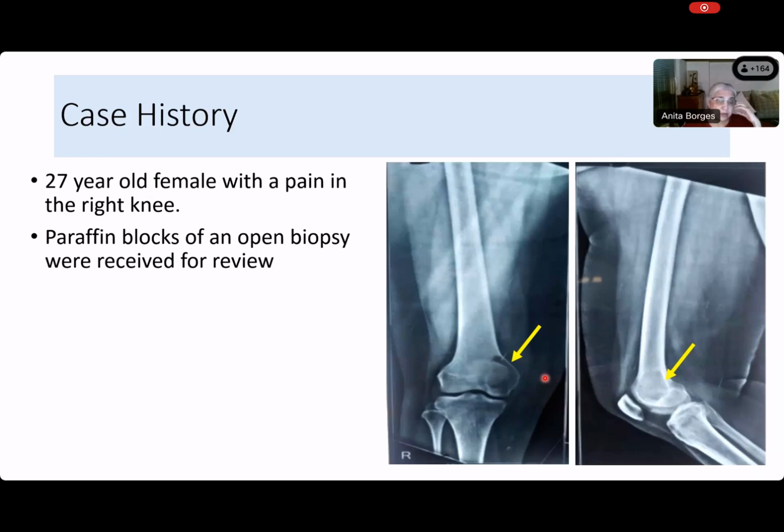Does it have internal trabeculations? You saw the case that we just finished. Okay, it has internal trabeculations, right? That means there were septae inside. That is what a trabeculum is. There are septae inside. Are there septae here? No, ma'am. No, excellent. There are no septae.